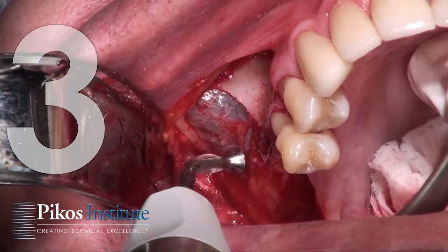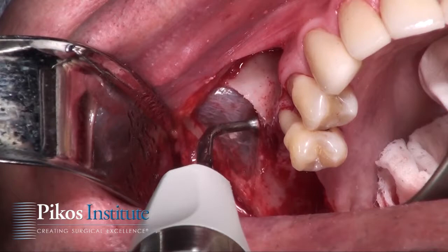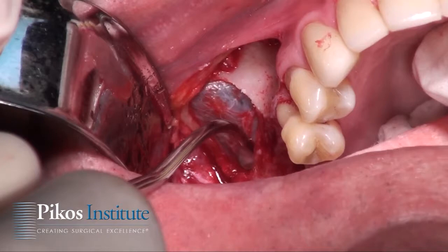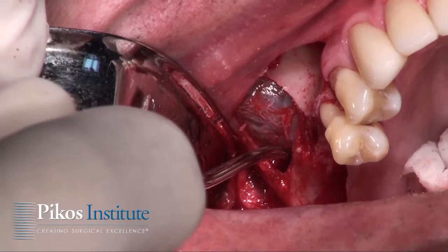At this point we take the EL1 and undermine the entire membrane circumferentially, which sets us up nicely to use our curettes. The goal is to always hug bone — get right against bone — and delicately separate the membrane from the bony walls and bony floor, checking always for perforations.